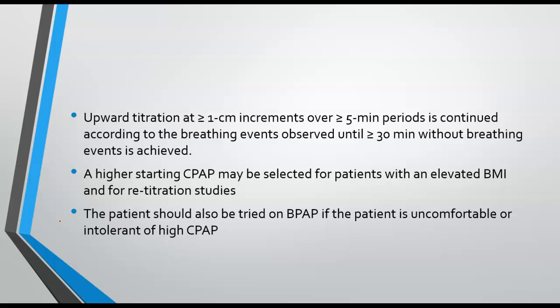Or in the case where the patient is already on a CPAP of 12 and is complaining of excessive daytime sleepiness, and the doctor wants to see what's going on with a repeat study, you don't have to start from 4. You can start at a CPAP of 12 or 1 to 2 centimeters down, see what is going on, and gradually titrate.